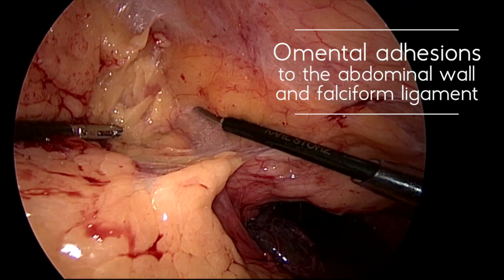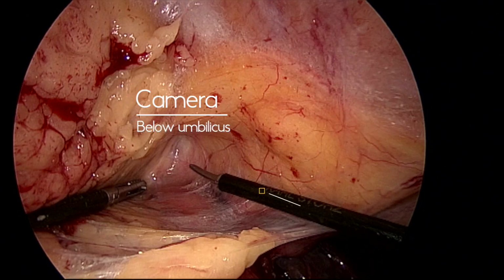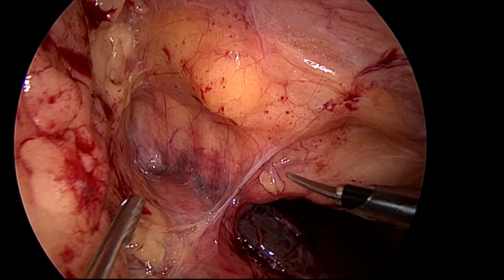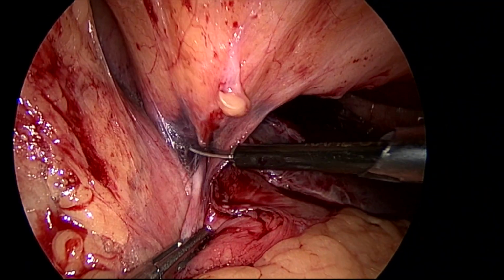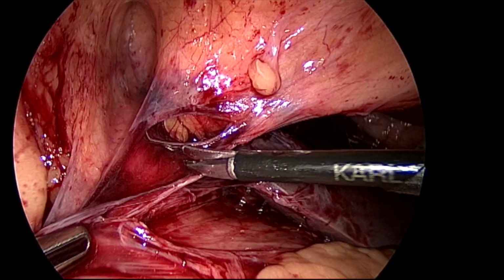So I'm releasing the adhesions. This is the omental adhesions from the falciform ligament I'm releasing now. In this case, I put the camera below the umbilicus, and the working instruments are coming from the left lumbar and right lumbar. Once I clear all the omental adhesions and identify the liver, then I have to identify the gallbladder. Then only can I perform the cholecystectomy. So there are exposure difficulties in this case.